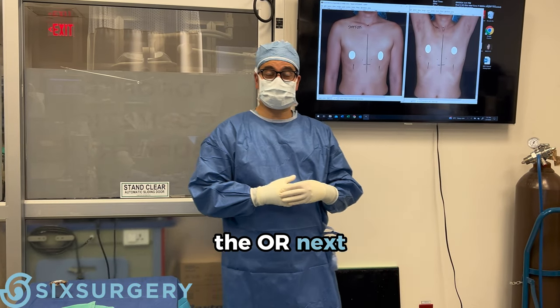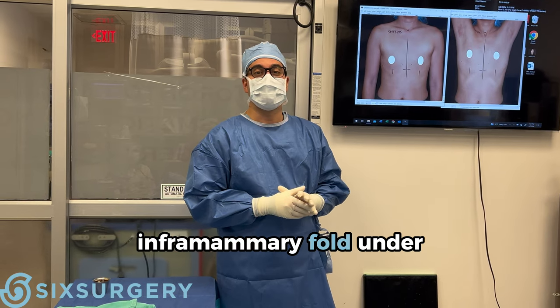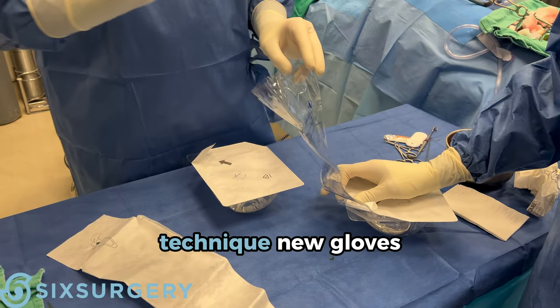Welcome back to the OR. Next surgery is a breast augmentation going through the inframammary fold, under the muscle. We use moderate profile silicone implants, 215s. No-touch technique, new gloves.